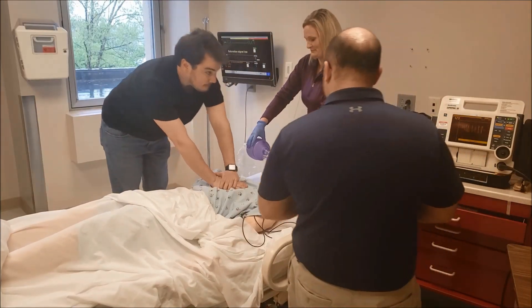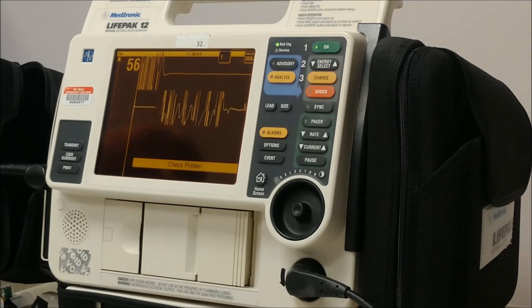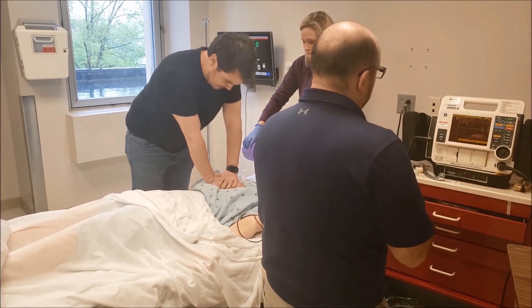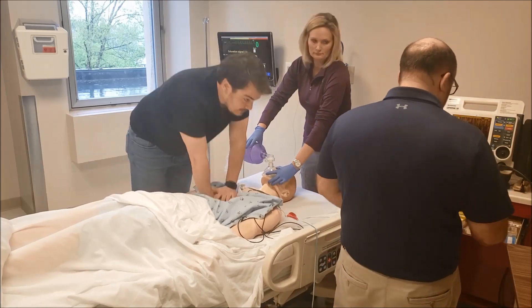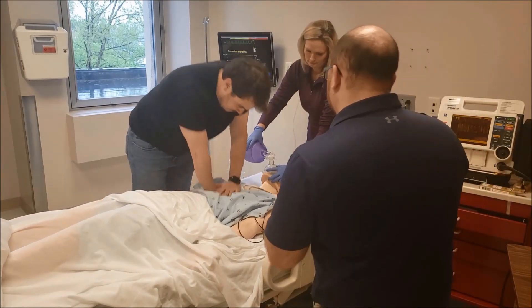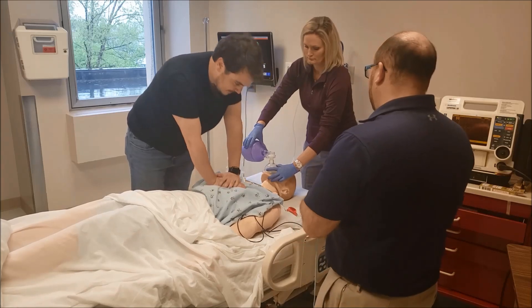It's been two minutes. Hold CPR, reassess our patient. We seem to be in asystole — we'll check our leads. We're in asystole. Continue CPR. At this point we're going to give our next vasopressor, because it has been three to five minutes since the last one — epinephrine one milligram, rapid IV push. Our fluids are still open. We're going to continue to look at those H's and T's. Blood gas is within normal limits, potassium is within normal limits.